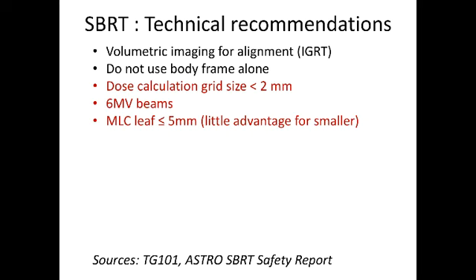There should be some way of assessing motion in the thorax and abdomen. And then some requirements on treatment: a physicist being present at the first fraction and available nearby for remaining fractions, and the radiation oncologist to approve alignment images prior to each fraction. And those have obvious workflow implications, especially in certain clinical arrangements.